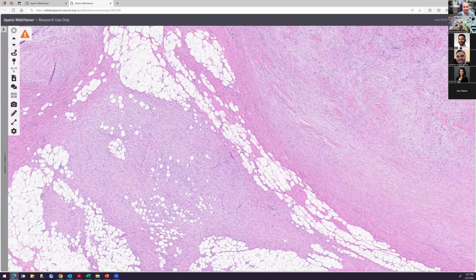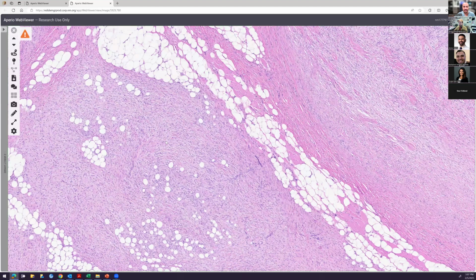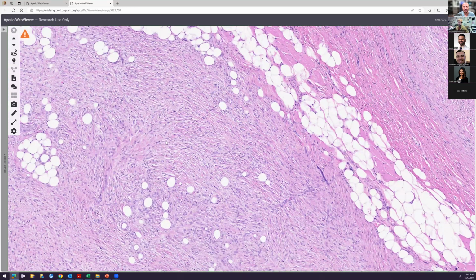But what else is MUC4 positive in? GI stuff. Yeah, GI stuff, right? It's MUC4, an epithelial mucin. So this is one of those weird tumors that is associated with an epithelial type mucin. There are a couple of others, right? But there's one other epithelial mucin that is often expressed in low-grade fibromyxoid sarcoma as well. What is that? Do you guys know?